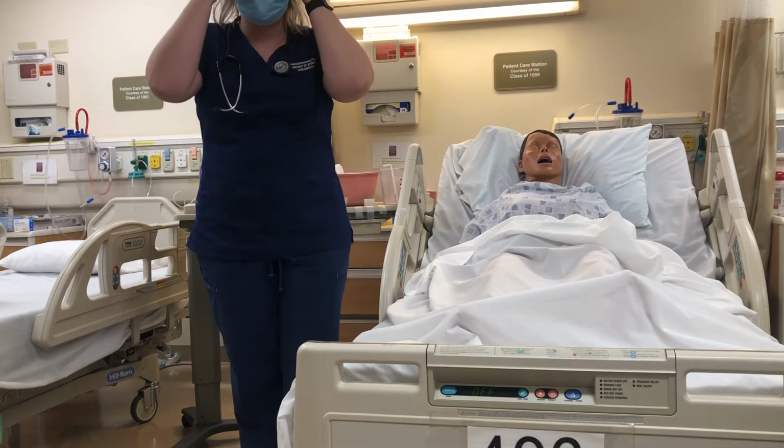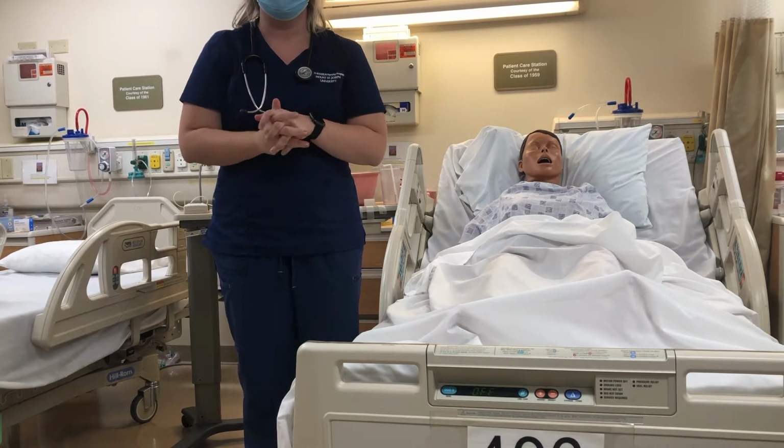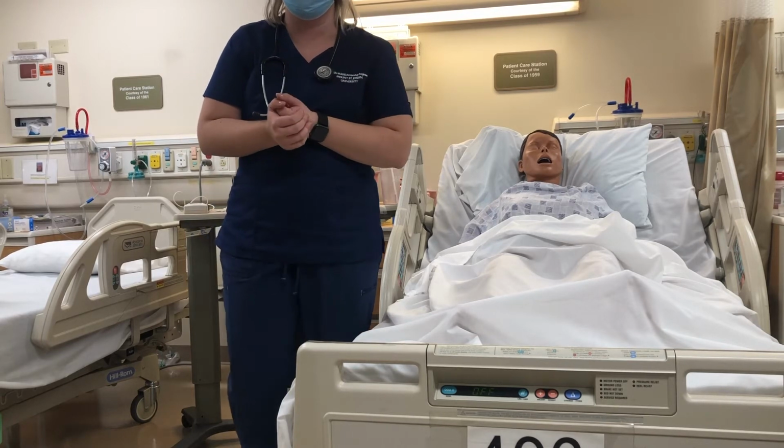Okay, so I just received orders from the healthcare provider that I need to place an NG on this patient. So I'm going to gather all of my supplies, go introduce myself to the patient, and begin the procedure.